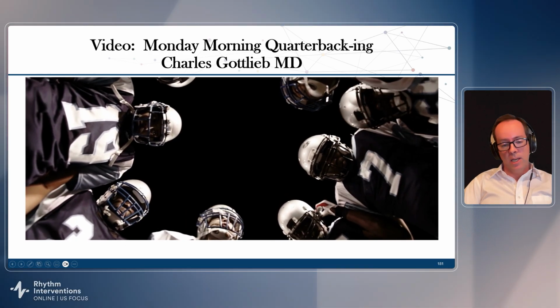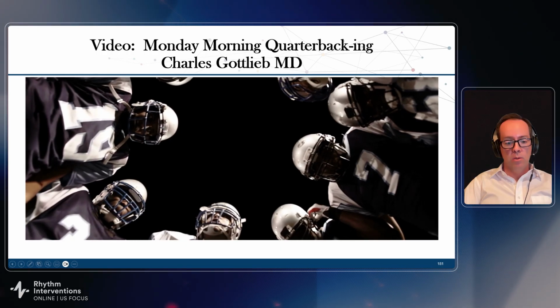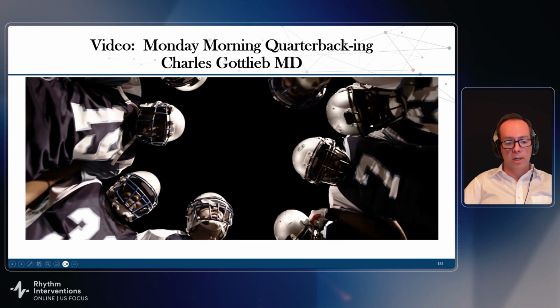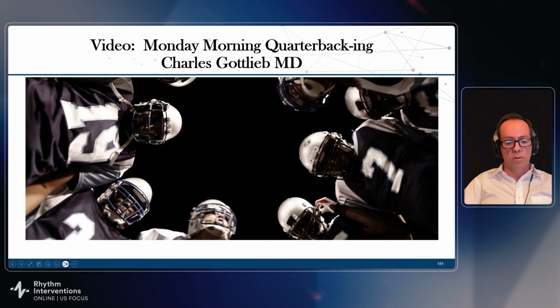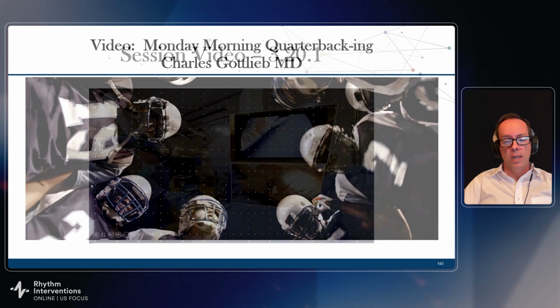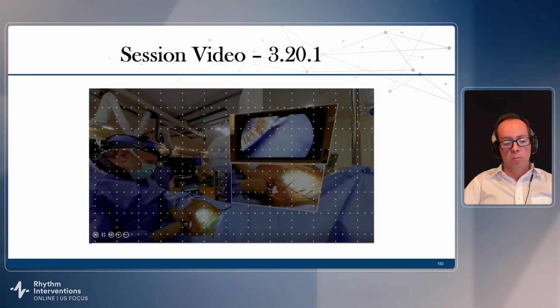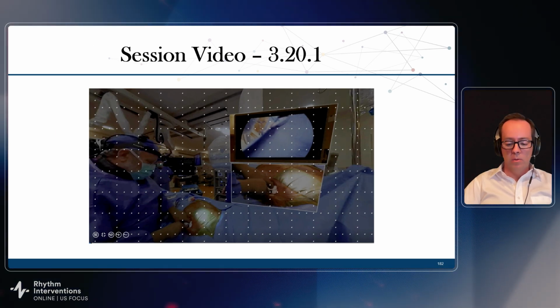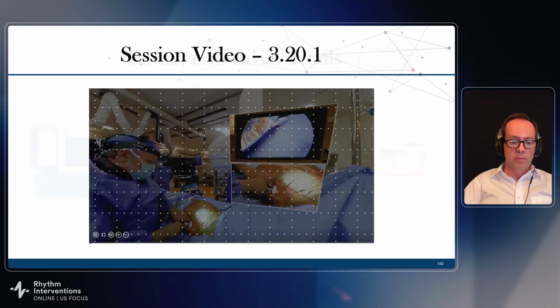But it's actually probably better to comment on someone else's, because you see different styles and different approaches, and I'm sure our panel has different styles and different approaches to this implant. The point of the video, though, is that this is purely a surgical thing, and the learning curve all comes from the surgery. If we could play that video.